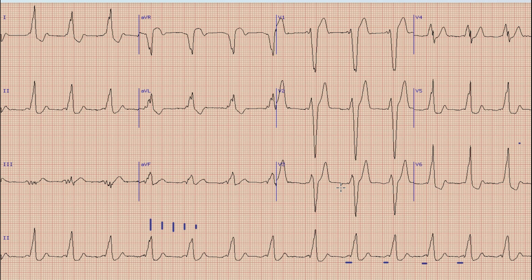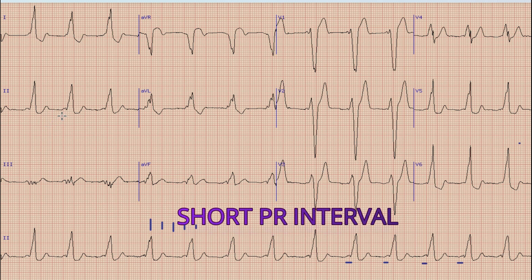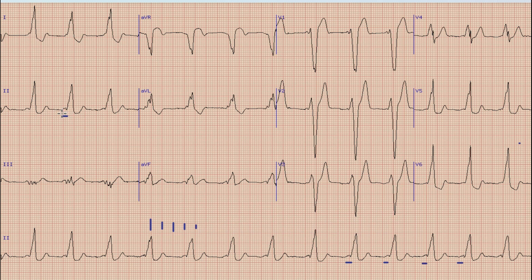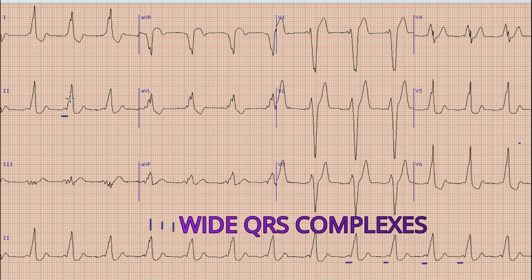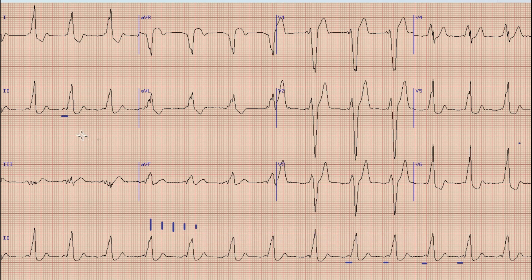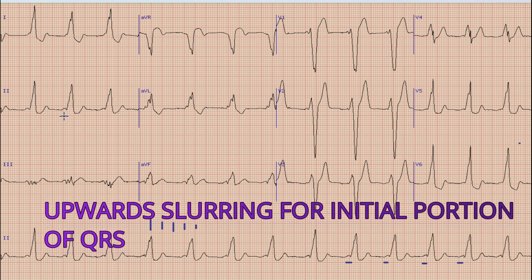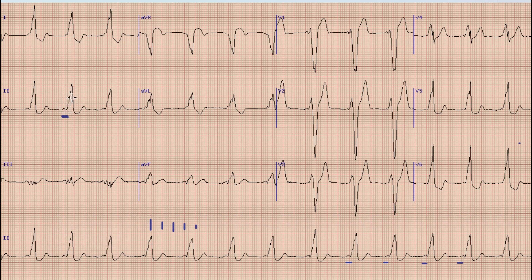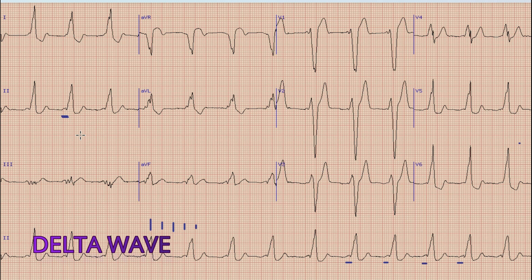We can note an important and striking feature in this ECG: the PR interval is short. You can see that there is a P wave which is immediately followed by the QRS complex. So this is a short PR interval, as well as a broad QRS complex — more than 120 milliseconds. Also, the initial portion of the QRS complex is slurred upward. This initial upward slurring combined with a broad QRS complex is called a delta wave.